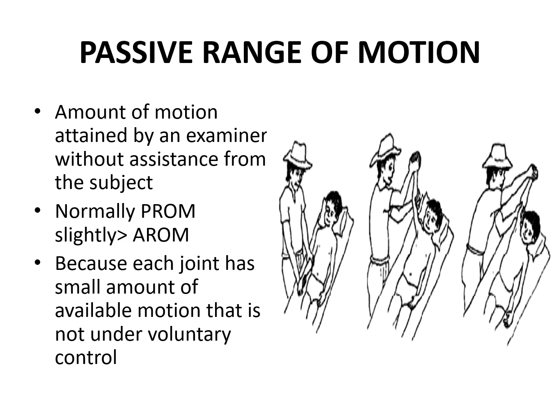Coming to passive range of motion, I hope the active range of motion is clear. Active, always remember, is done voluntarily by the patient. There is no assistance given by the therapist. When you measure that movement in degrees using a goniometer, that is known as active range of motion.